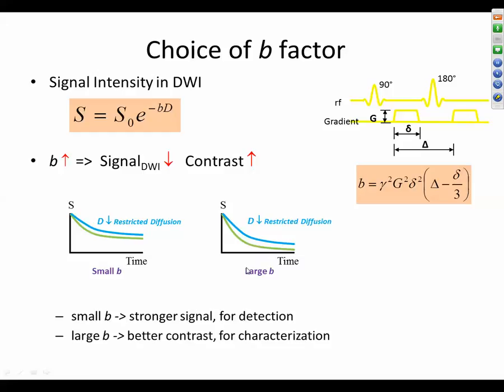And that's going to be contrast between lesions that restrict and don't restrict? Most lesions are diffusion restricted, but they restrict to different degree. Okay. Some are severely restricted, some are slightly restricted. So it helps me tease out which ones are very restricted versus not. Oh, yeah. So according to the extent of restricted diffusion, you can characterize which type of lesion or tumor it is.